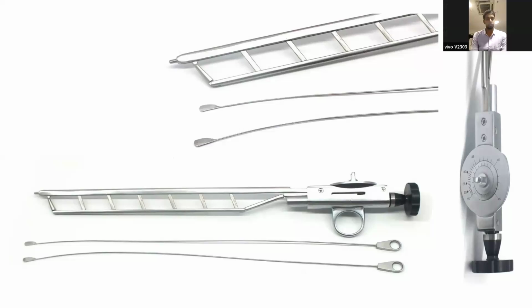Yes. And advantages, as you rightly said, it would open up the urethra so that there is no friction between the sheath and the urethral wall. The compression on the urethral wall is less, ischemia may be less, and hence the long-term stricture may reduce. Prevents meatal stenosis also. True.